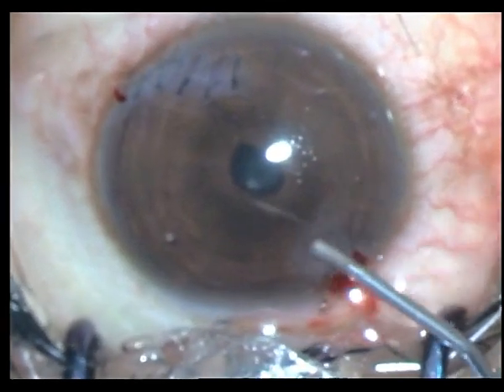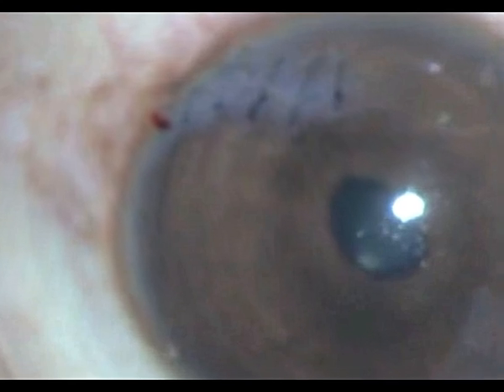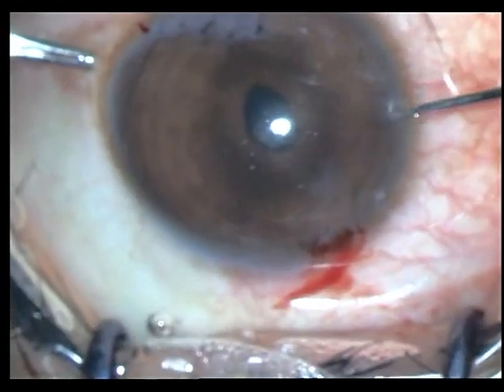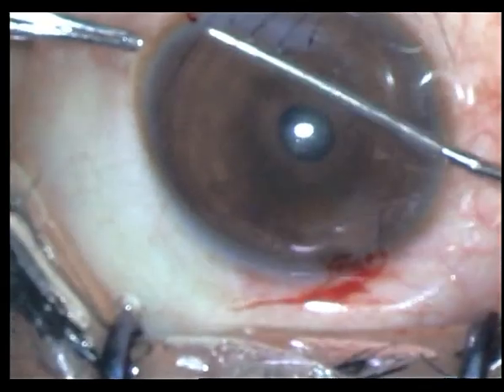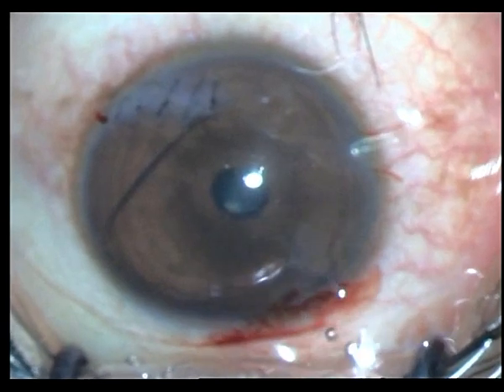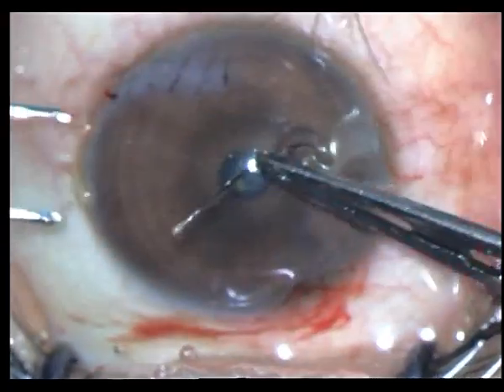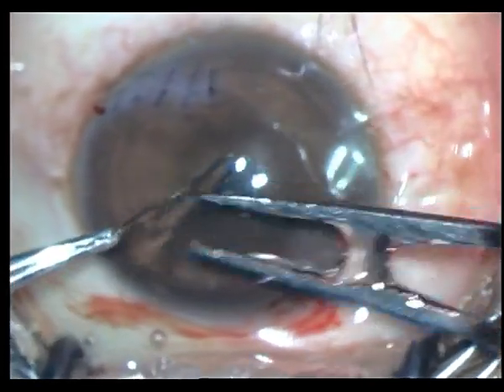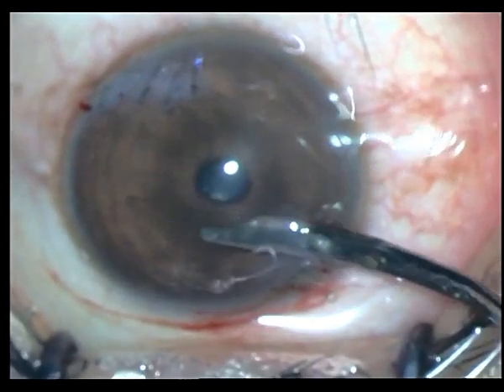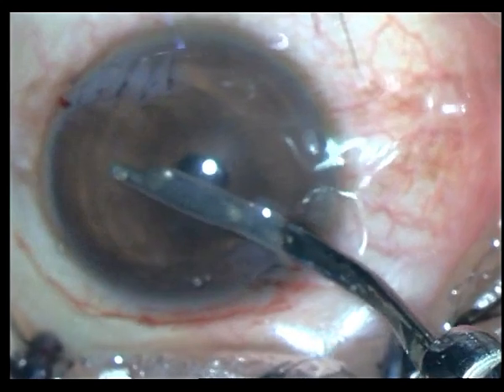I put in some viscoelastic and there you can see in the magnified view the hair follicle. I put in my 2.8 millimeter keratome incision, put in a side port, and put in pilocarpine. You can see the peaking of the pupil — that's where the uveal tissue is incarcerated in the wound and I have released it with my Sinski hook. Then under HPMC I very carefully put in my Utrata forceps and remove the hair follicle. I put in pilocarpine to protect the crystalline lens from inadvertent damage.